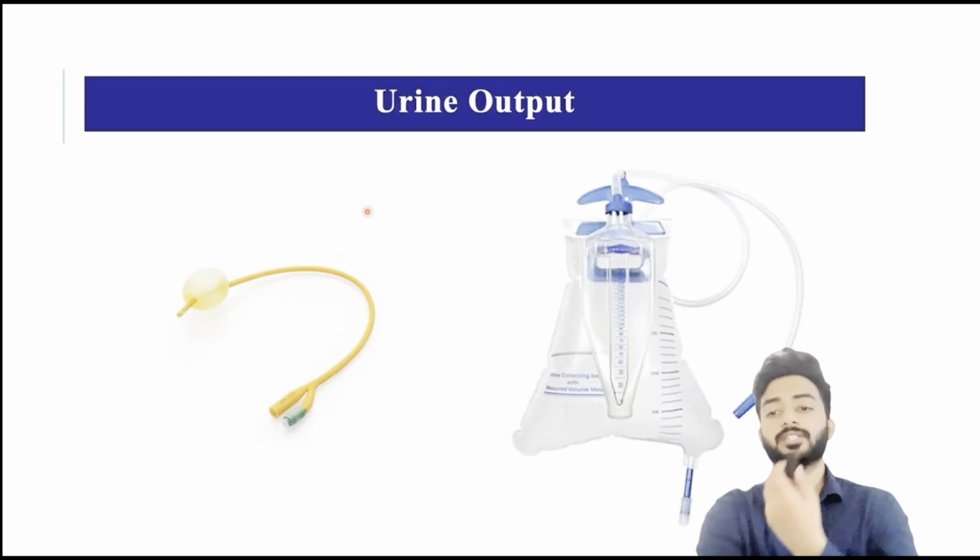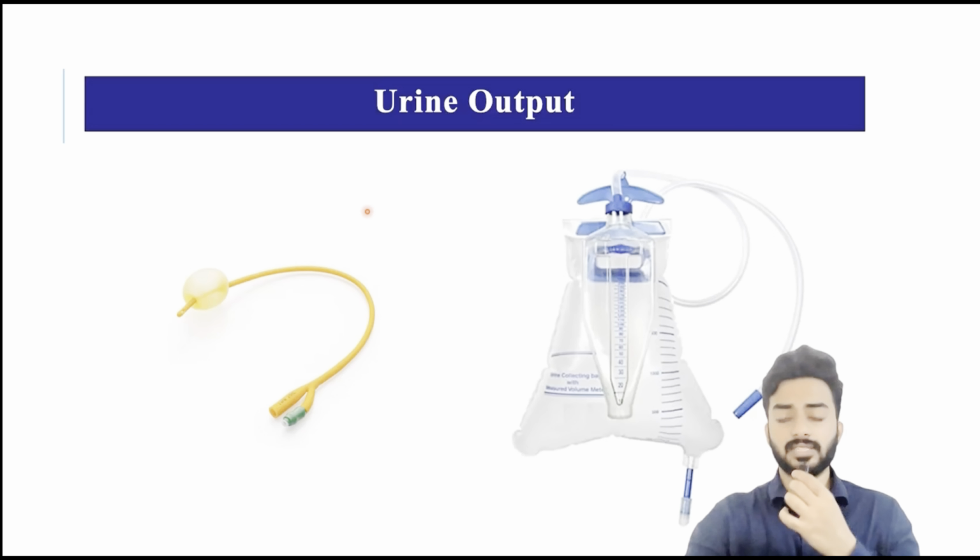Next monitoring is urine output. Very simple monitoring. You just have to put the Foley's and connect it to the bag. We also have electronic urine output monitoring. This is just the basic monitoring which we can see visually. Drop by drop can be monitored.